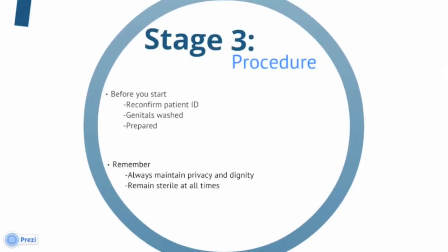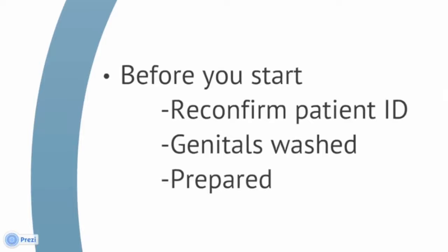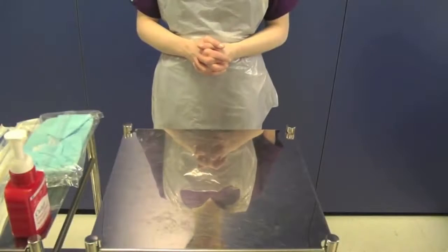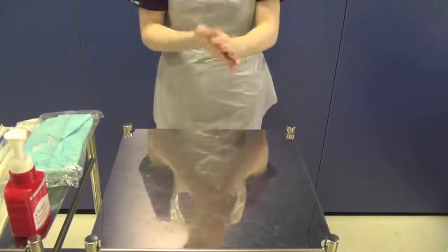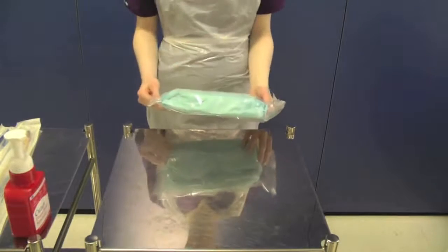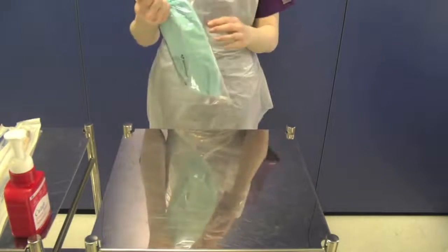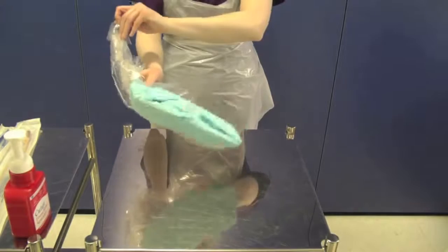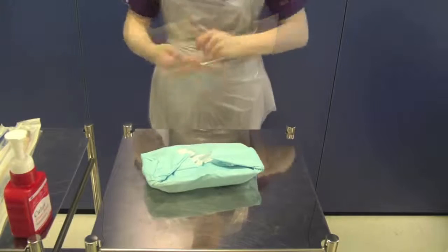Stage 3 involves performing the procedure itself. This video will demonstrate how to gather the equipment seen in stage 2 and correctly perform catheterisation. Before you start, reconfirm patient ID, ensure that they have washed their genitals, and that you and the patient are prepared. Once you have cleaned your trolley, don an apron and decontaminate your hands using the WHO seven-stage hand washing technique. This must be used every time you decontaminate your hands. Take your catheter pack and check that it is in date. Open the pack onto the trolley without touching the contents. You must decontaminate your hands as you have been touching outer packaging.